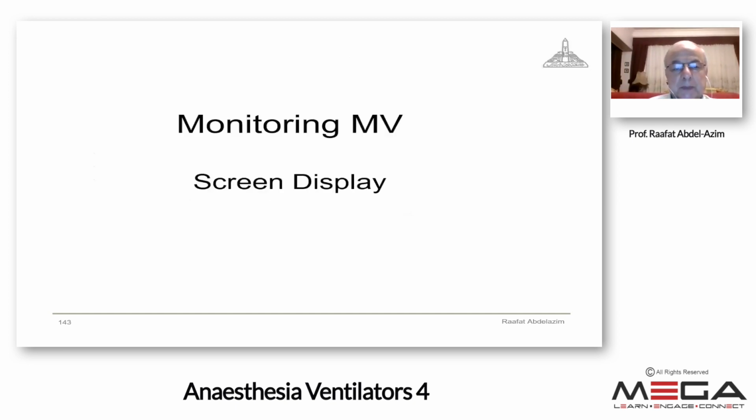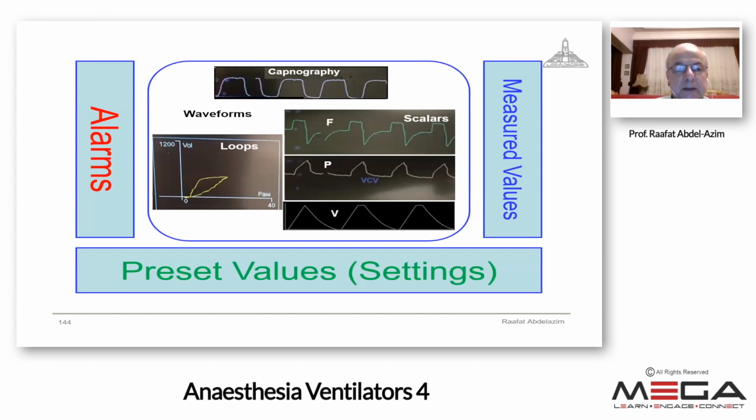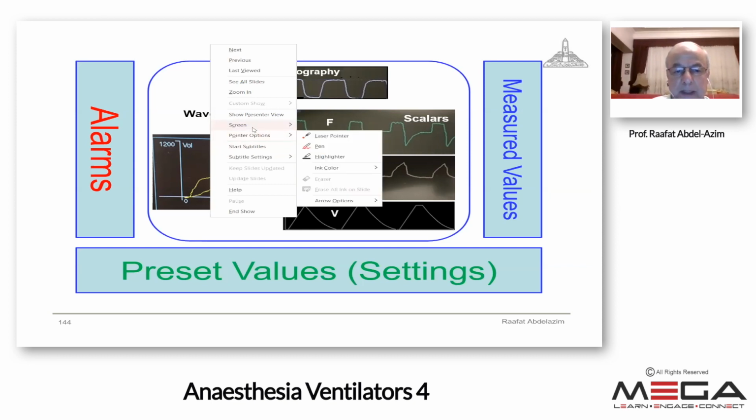Today, I will talk about how to monitor the mechanically ventilated patient. To monitor the mechanically ventilated patient, we have to have the screen display. The display of the screen consists of a numerical display and a graphical display.